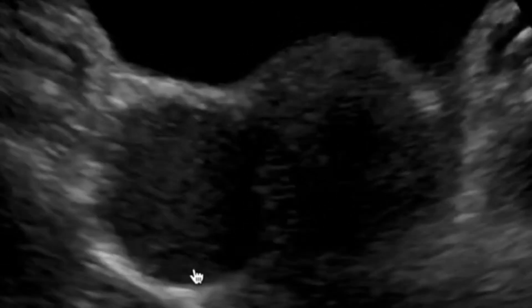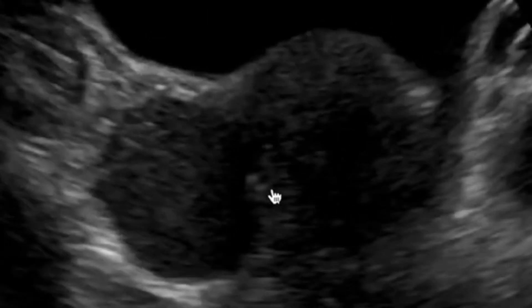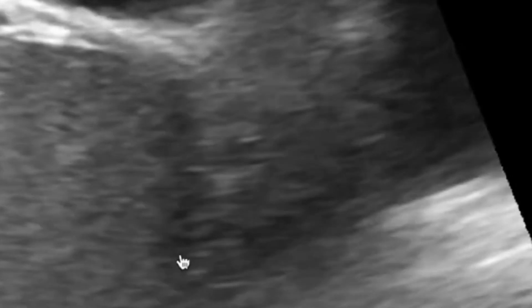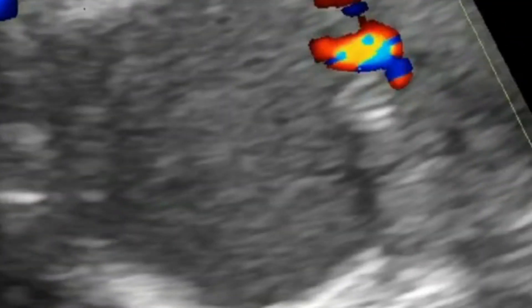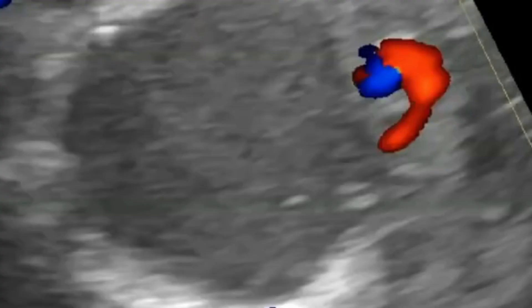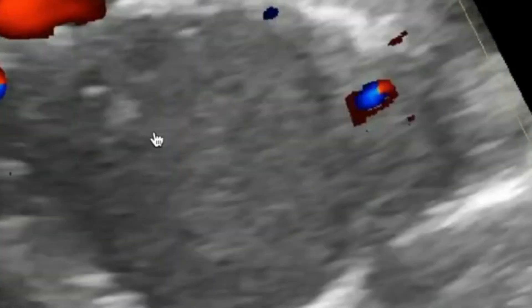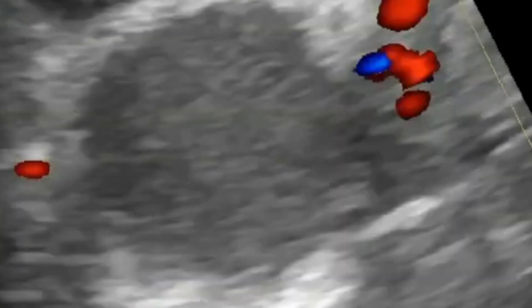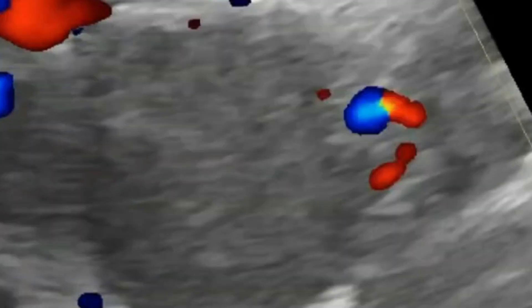To differentiate it from a simple cyst, the gain is decreased. If it were a simple cyst, it would present as an anechoic structure. However, it remains hypoechoic with internal echoes due to dense echogenic material, confirming a typical chocolate cyst. On color Doppler, there is no color flow within the cyst, which also differentiates it from a solid lesion, as a solid lesion would demonstrate internal vascularity.